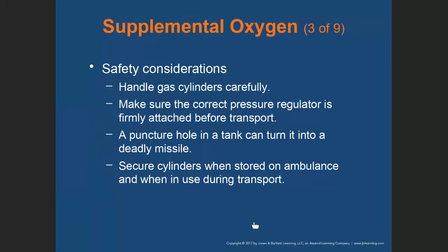Handle gas cylinders carefully. Make sure the correct pressure regulator is firmly attached before transport. A puncture hole in a tank can turn into a deadly missile. Secure cylinders when stored on ambulance and when in use during transport.